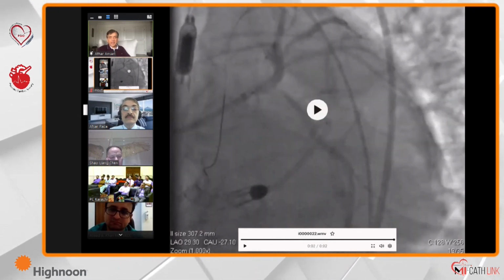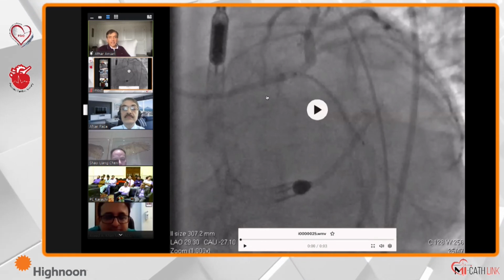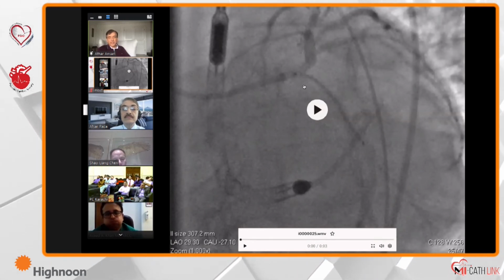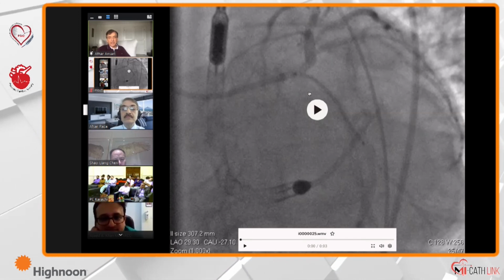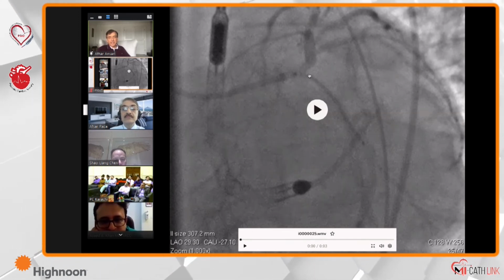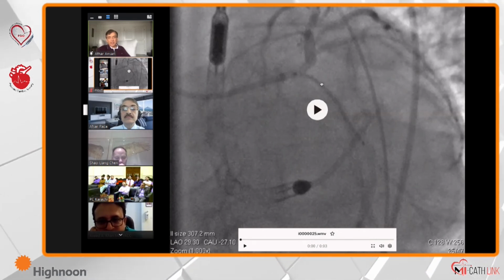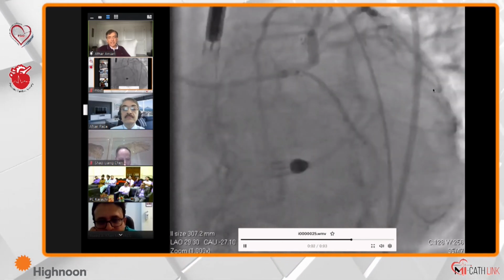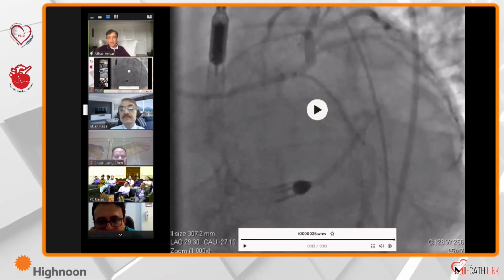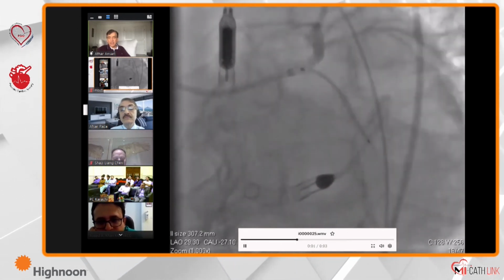And finally, there's more. Then I put a second stent using kind of the same concept of T, just getting it right across with this left main stenting and the LAD stenting, and then making a marker and putting the second stent. So you can see it's right there, maybe abutting a little bit to the left main, I cannot swear, but I'm not doing any IVUS.